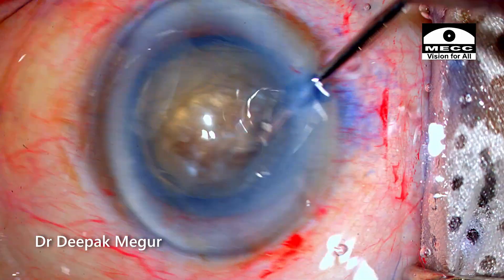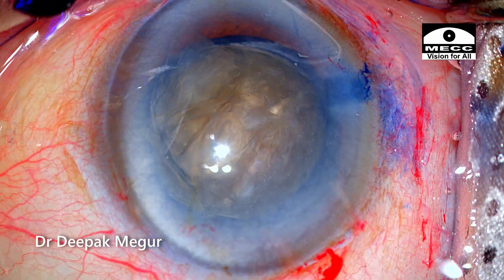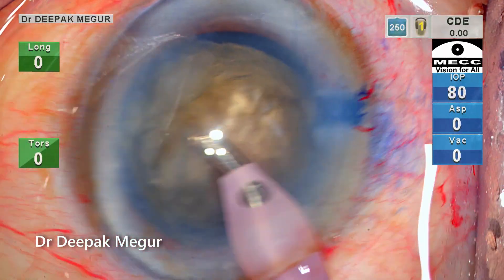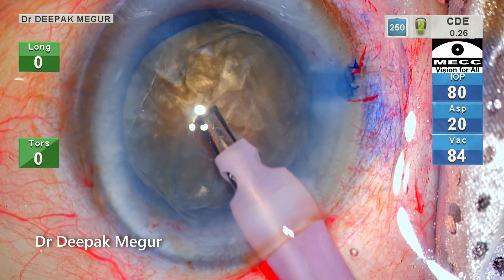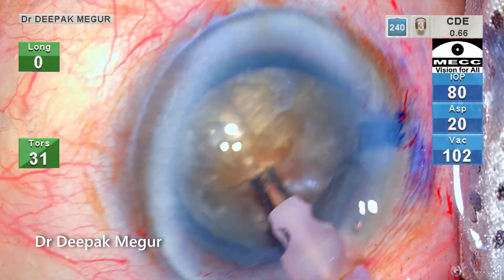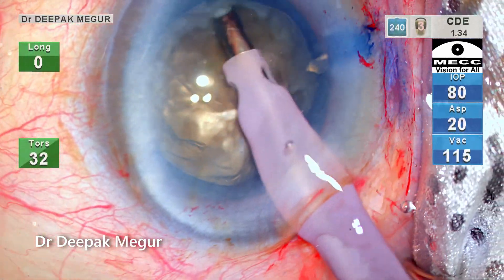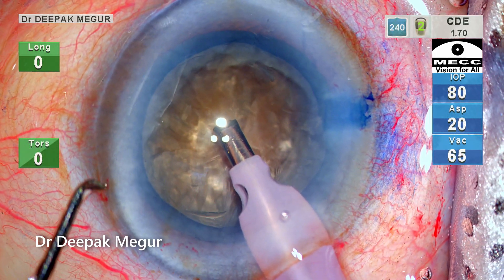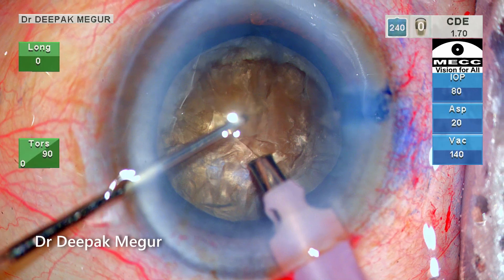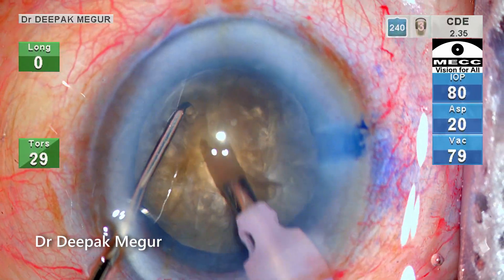I rotate the nucleus a couple of times and now is the time to phaco. After aspirating the superficial cortex and epinucleus, I am trenching into the substance of the nucleus to create a small central pit.